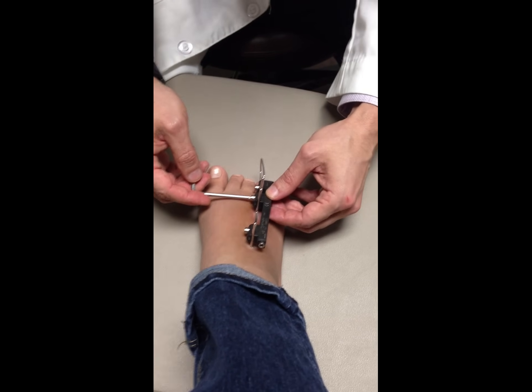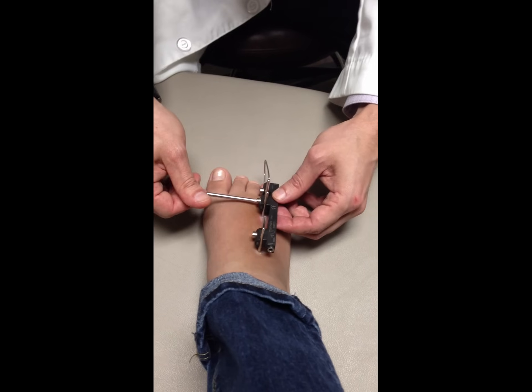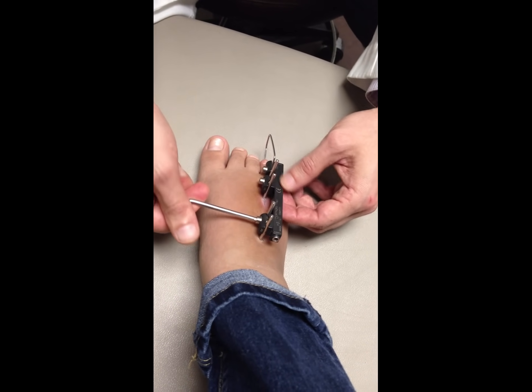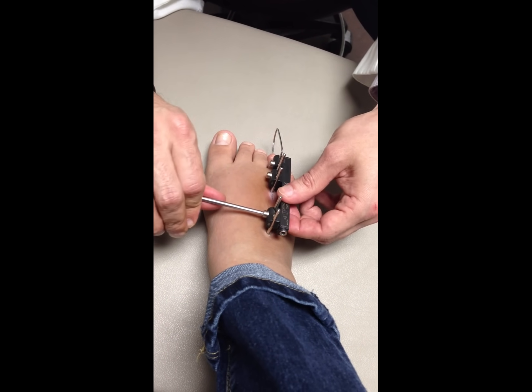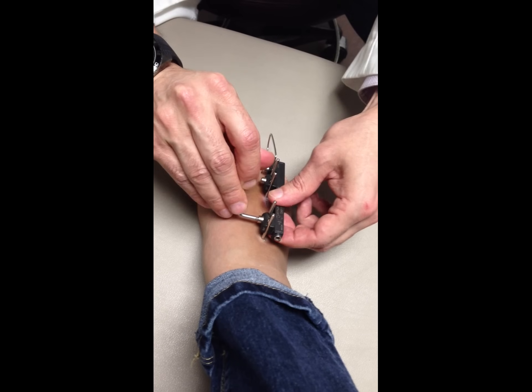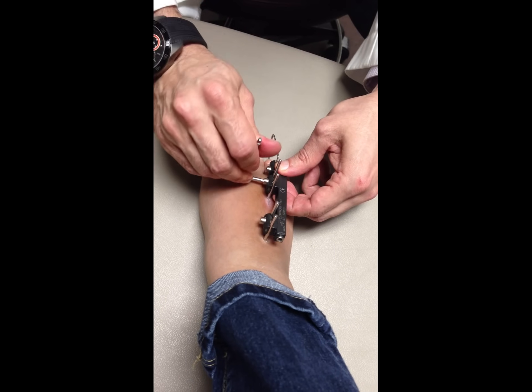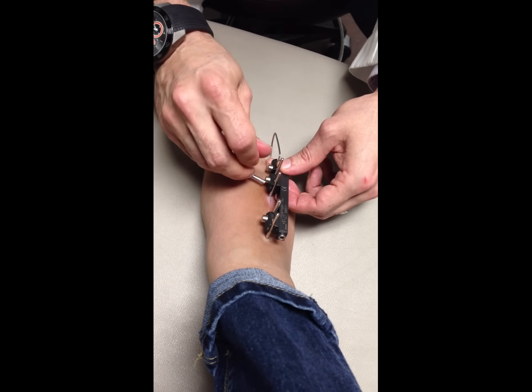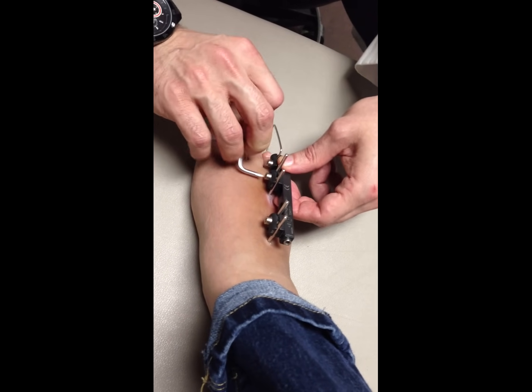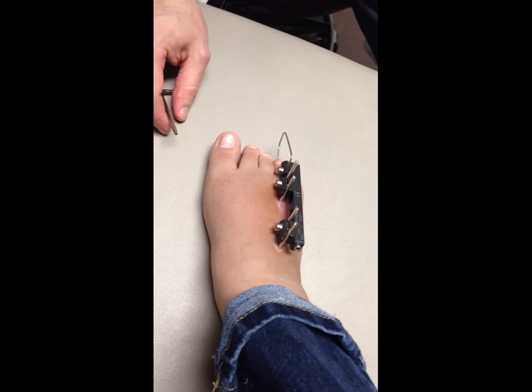You must feel like something — kind of like something is giving in and relaxing. It's a little tingling. That's what we want to feel, and then we're just going to tighten it back up. What that did was transfer the load slightly from the device back to the bone. Now when you start walking, you might feel a tad bit more — I wouldn't say pain, but a little bit of aching — knowing something is different than before you walked in today. That's what's called dynamization.